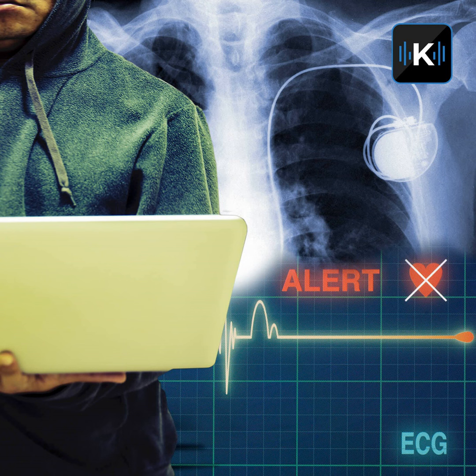Well, there's a lot of devices, and some of them you probably wouldn't even think of, such as devices that are used to do surgery on your eyes with a laser, and those devices have software on them. That software has vulnerabilities. Those devices are connected to a clinic or a hospital network, typically a clinic network. And for instance, if they're compromised, then the instrument that's used to track your eye while the laser is cutting your eye, if that tracking is skewed, then the cuts can be made in the wrong places of your eye. And that's just one example of types of devices that most people wouldn't probably think of.